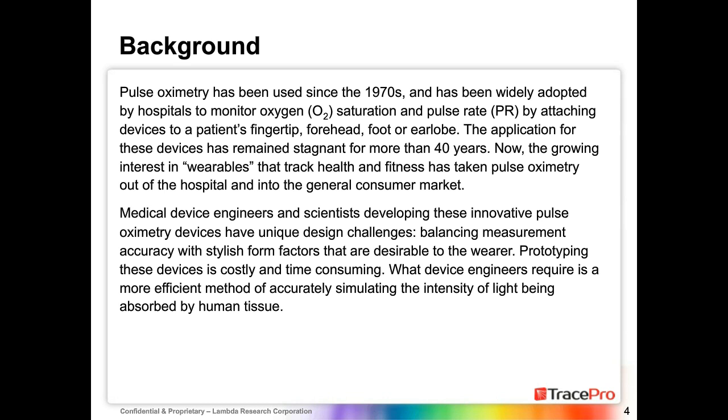Let's go into a little bit of background on pulse oximetry. Pulse oximetry has been in use since the 1970s and has been widely adopted by hospitals to do oxygen saturation and pulse rate monitoring of patients by applying a device to their fingertip, forehead, foot, or earlobe.